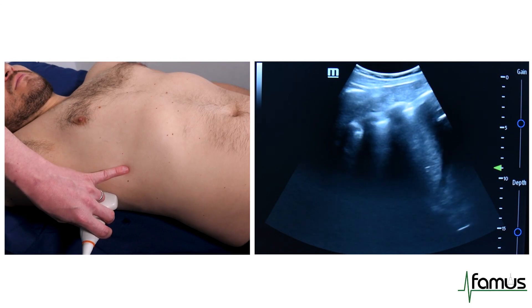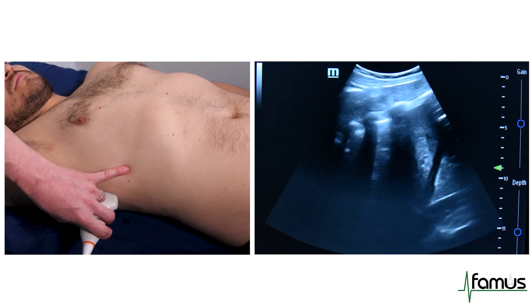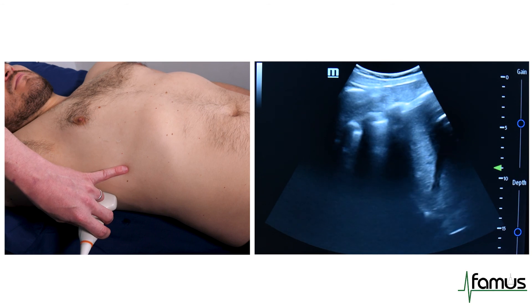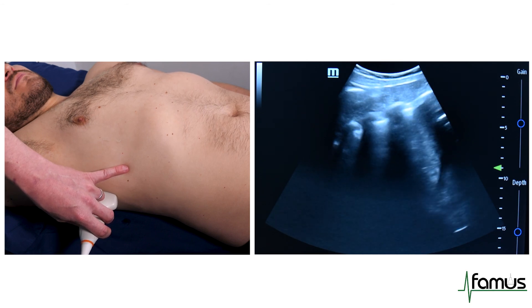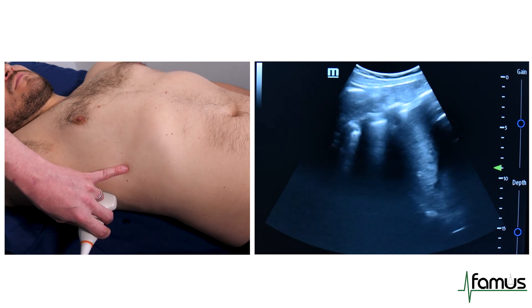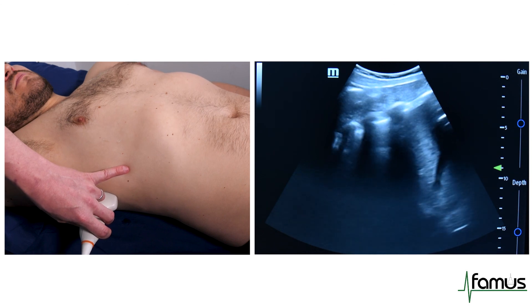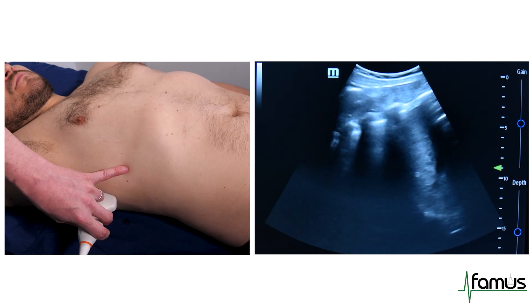I will complete my examination by scanning the same point on the left-hand side, where the image will be very similar except the liver will be replaced with a slightly smaller looking spleen. And that would then complete the six-point lung examination.